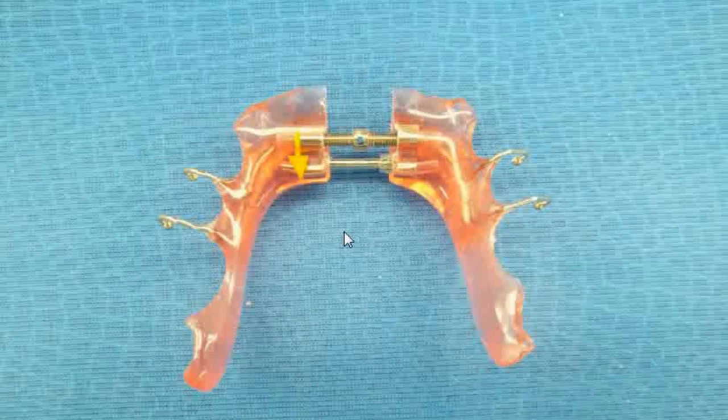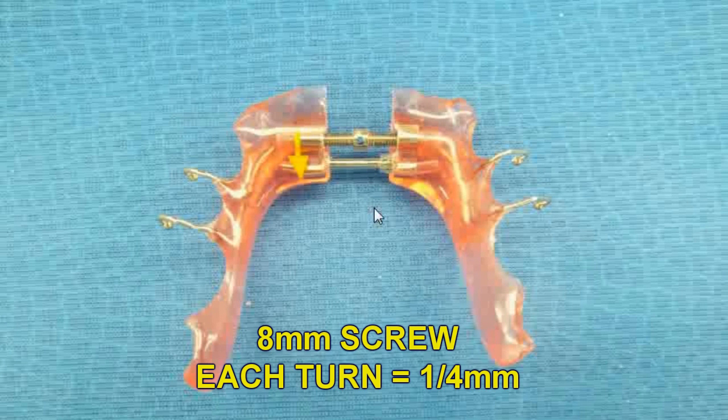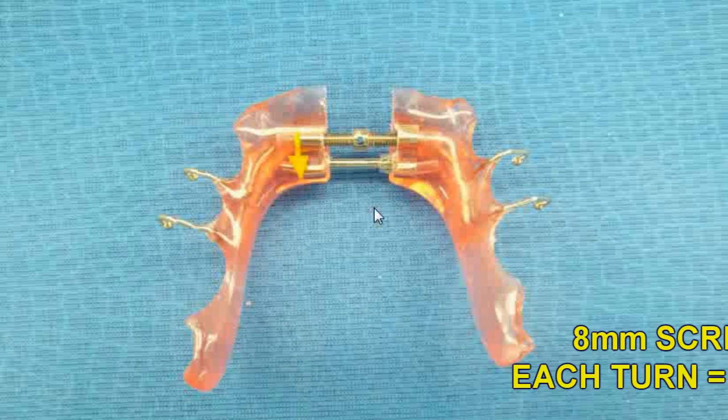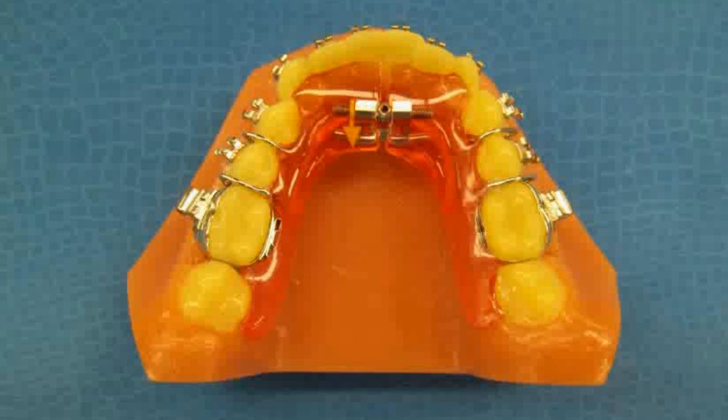The 8mm screw should be turned one turn twice a week. You can get about 1/2 millimeter of expansion each week, so you can judge how long you will need the appliance in place by the amount of space you need to create. You'll want to overcorrect by about 1 to 2 millimeters to account for any relapse that may occur. Once you have completed the expansion, you can continue on with your straight wire treatment.